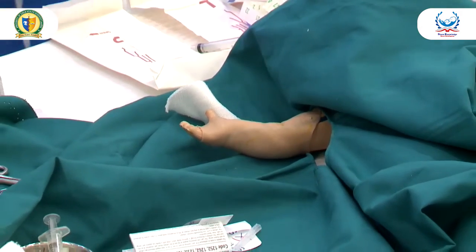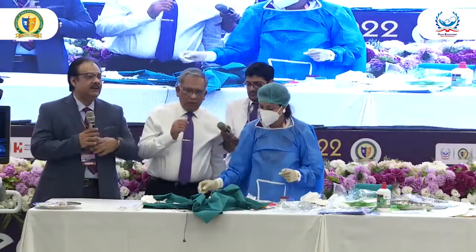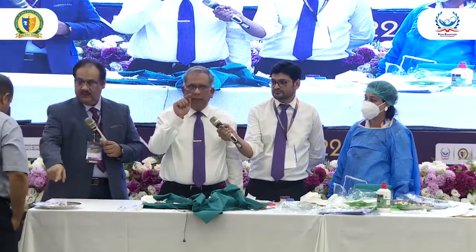So, any questions? This is the time you can ask questions. Anybody have any questions? We need to locate the tip. Either you use an X-ray, but the better thing is to use an ultrasound, and Dr. Ahmed will demonstrate how we can see the tip of the needle.